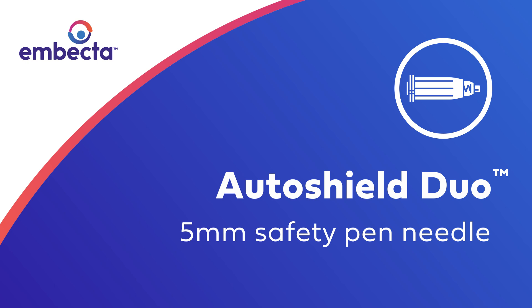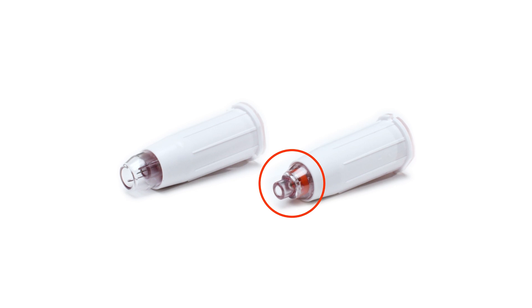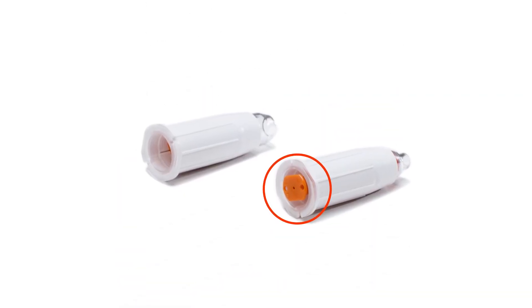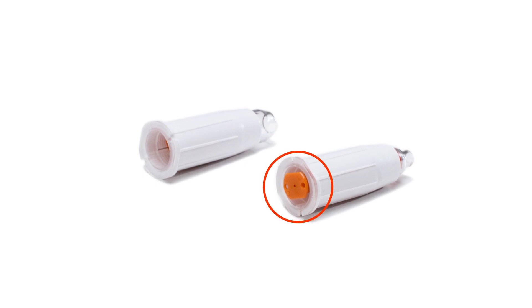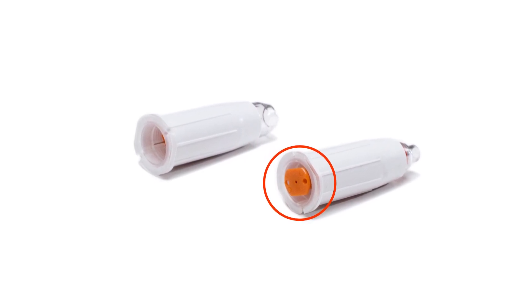AutoShield Duo is a safety pen needle that is designed to help protect healthcare workers and caregivers from accidental needle stick injuries. AutoShield Duo features two safety shields, one that protects the patient end of the needle and a second that protects the back end after the needle is removed from the pen. Both safety shields are automatically activated to help prevent needle stick exposure and injury.